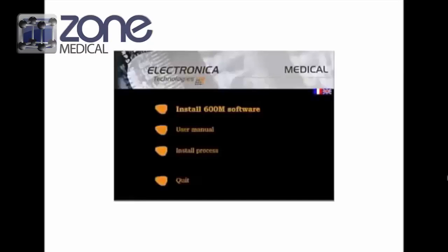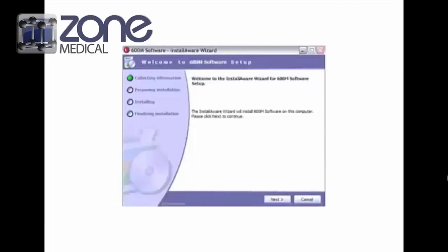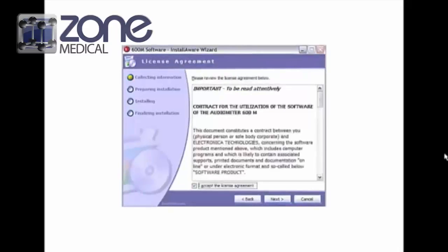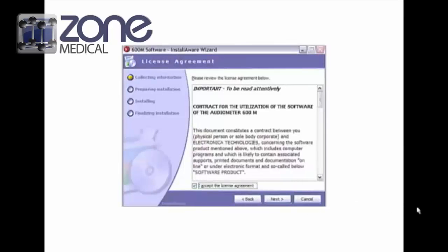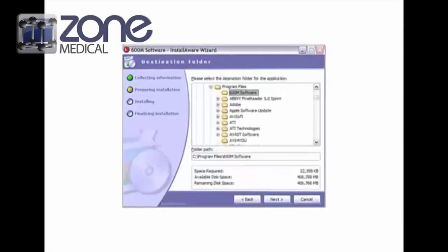Next, the Electronica startup menu will appear. Click install to continue. The installation wizard will come up, so follow the prompts and click next. Agree to the terms and conditions by clicking the box and then click next to continue.